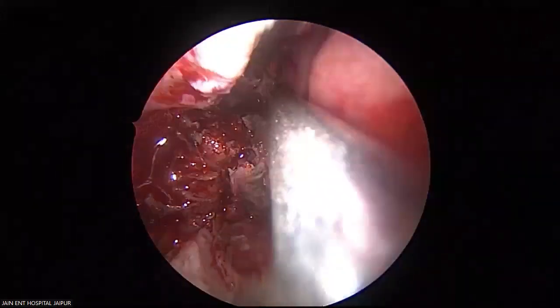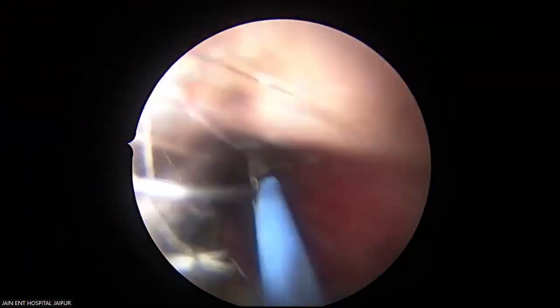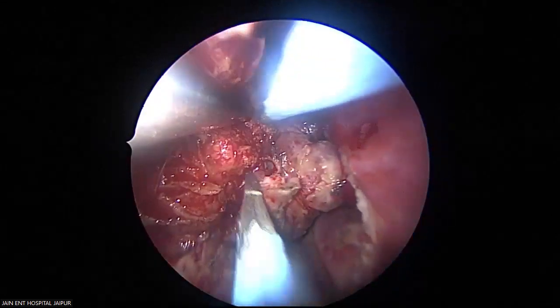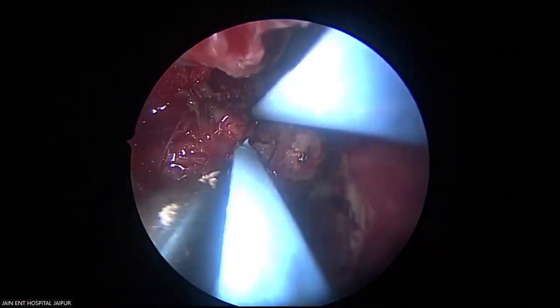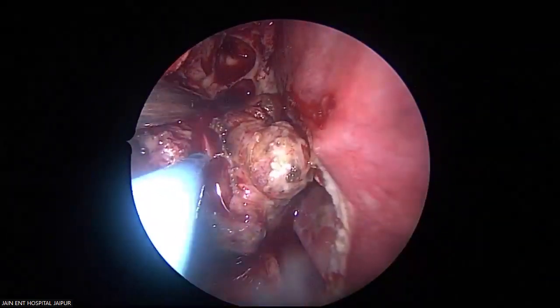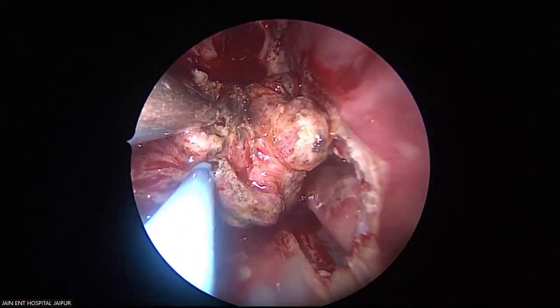Now what I'll do, before dividing with the coagulator, I'll take additional help from the bipolar here. See this bipolar? I'm using the bipolar at this bottleneck.